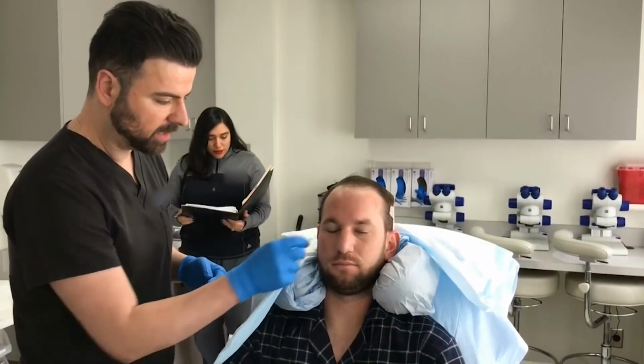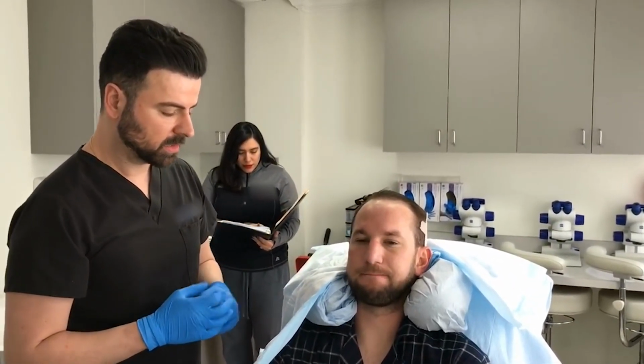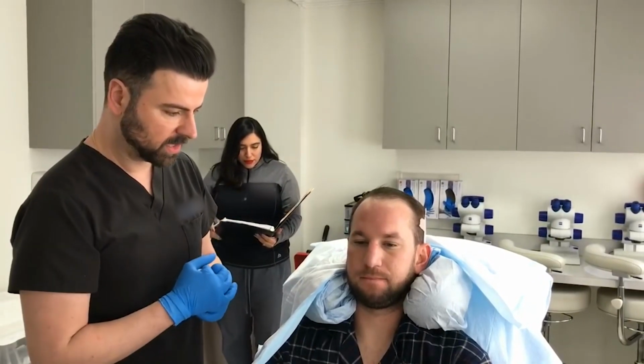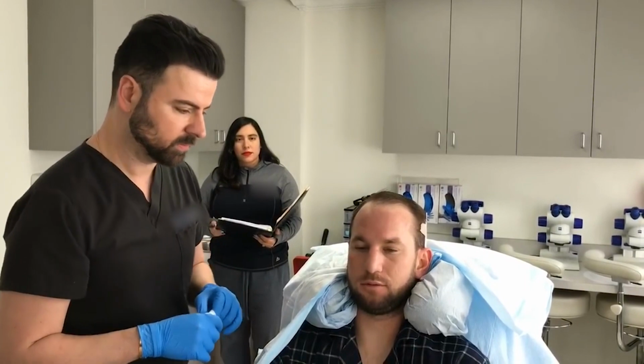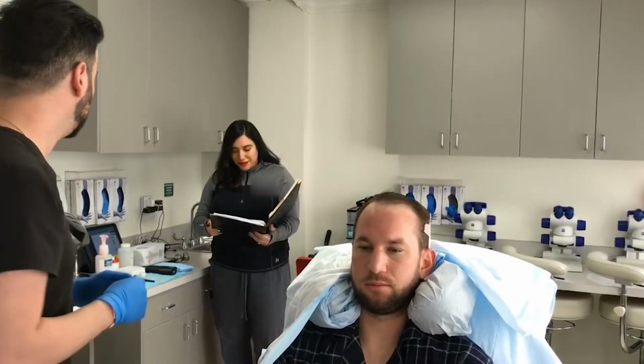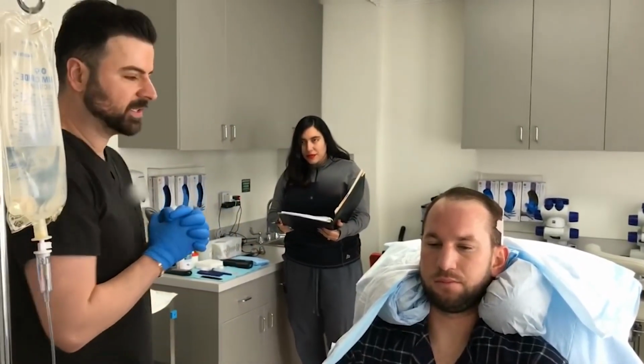Congratulations, Chad. So we're basically done with the harvesting phase, okay? And what we're gonna do next is we're gonna work on the design. So we're gonna take a few measurements. We're gonna measure chin to eyebrow and see where the perfect hairline that's suitable would be. Okay, sounds good. Flora, if you could give me the numbers and the percentages.